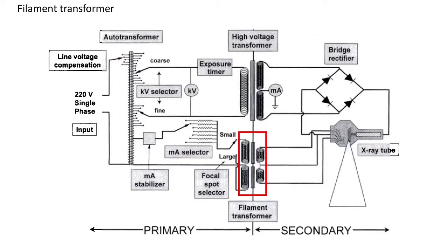When the temperature rises, the electrons on the surface of our filament begin to be emitted. This is how the process of thermionic emission is accomplished. It is accomplished by providing high current on the filament circuit.